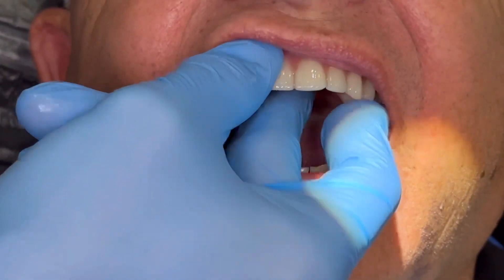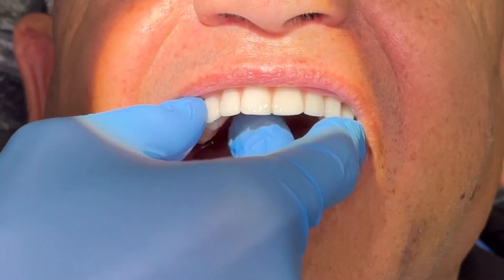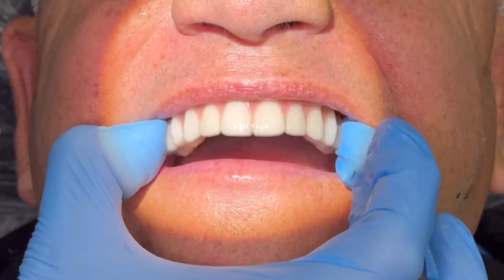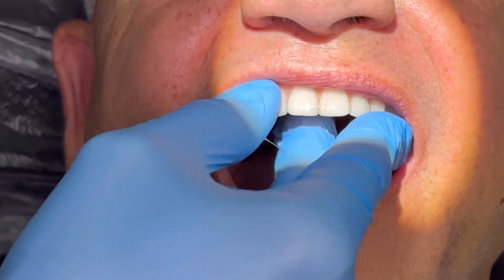We mill this out of a solid block of PMMA, and Kayla does a great job of painting on the gingiva after Austin does a great design. In this case he used 3Shape.